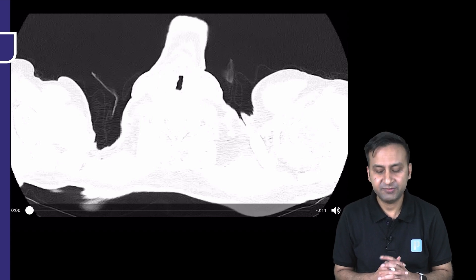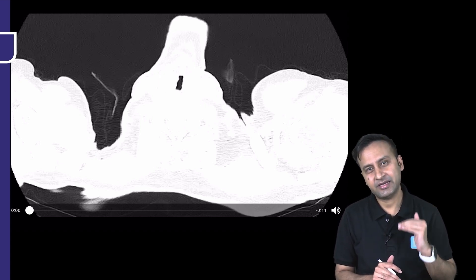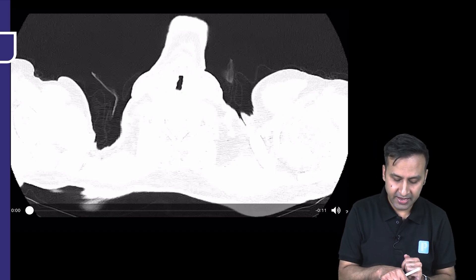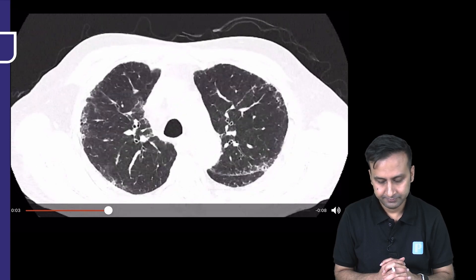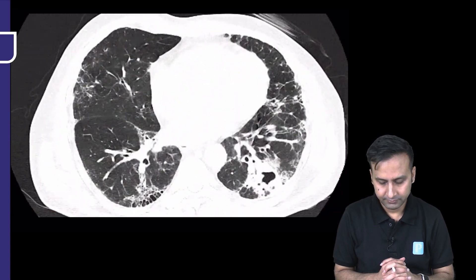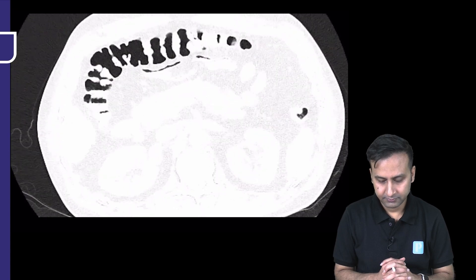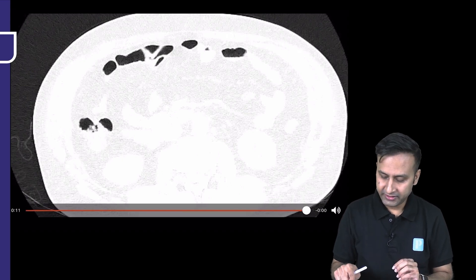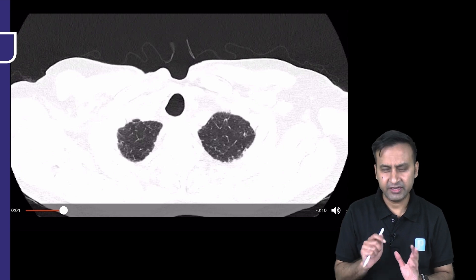This is a CT cine image — basically a volumetric image. I'm going to start from the top, that is from the apices, and go towards the diaphragm. I want you to have a look at this case and make your own observations. By now you might have all seen this case in complete totality. Let me show you the important observations on this cine image.